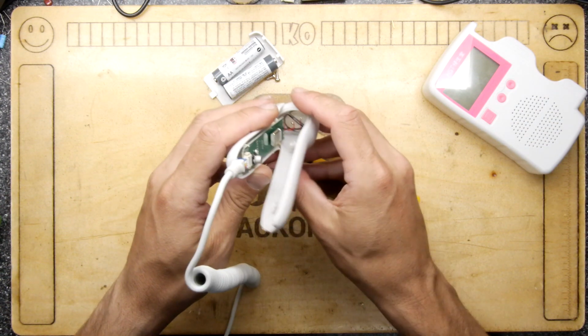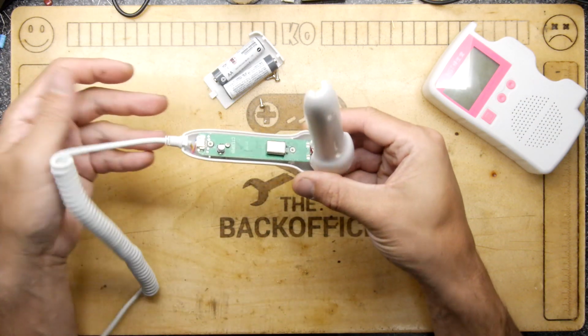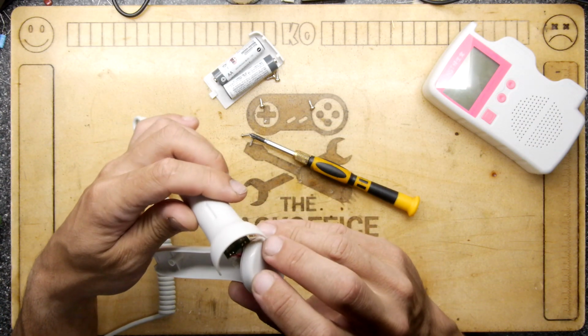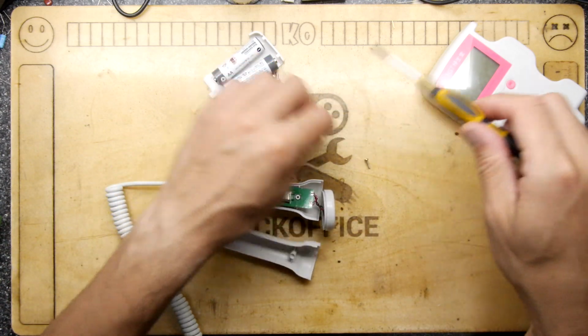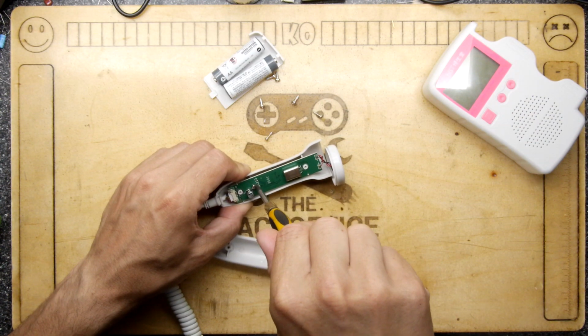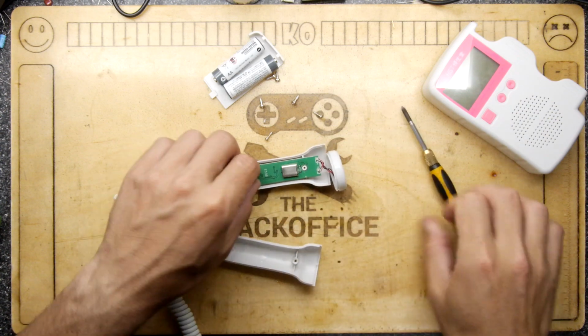well, I'm kind of right, but also very wrong in many respects. So you actually have a 3 megahertz timing crystal in here, and there is some stuff on this. It's a real PCB, so I think we have to dig a little bit further. So this is doing quite a lot of stuff. And in fact, there's only 4 wires going to the unit, so there'll be some conditioning going on in here.